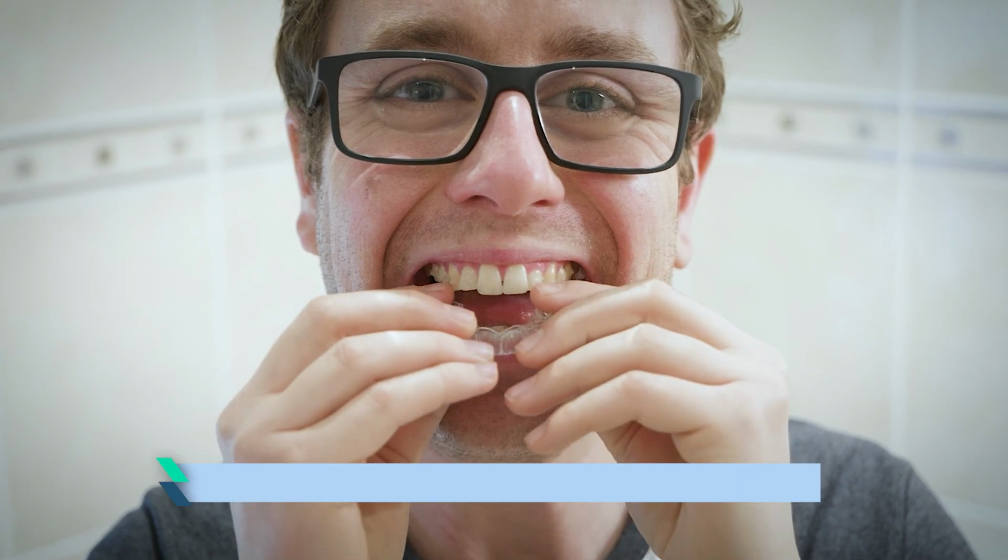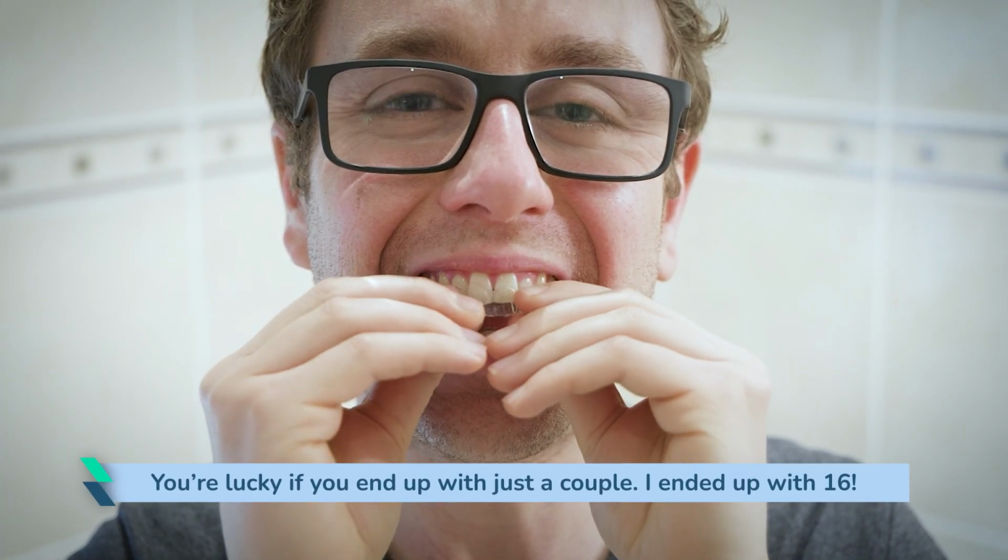You're lucky if you end up with just a couple. I ended up with 16. Your treatment plan will affect how many and when they are attached, but the likelihood is they will be fitted at the start and on for the duration.